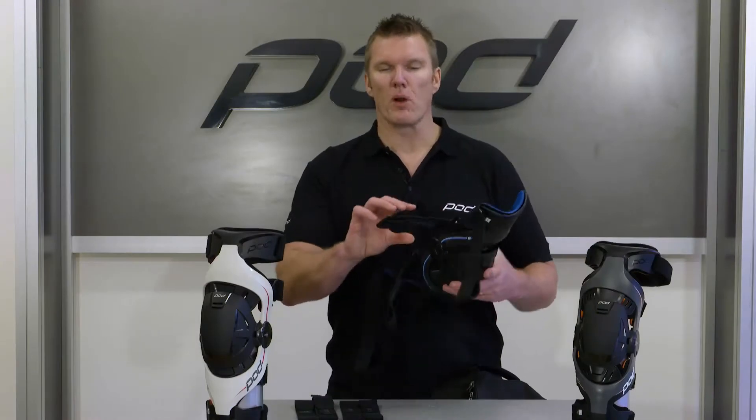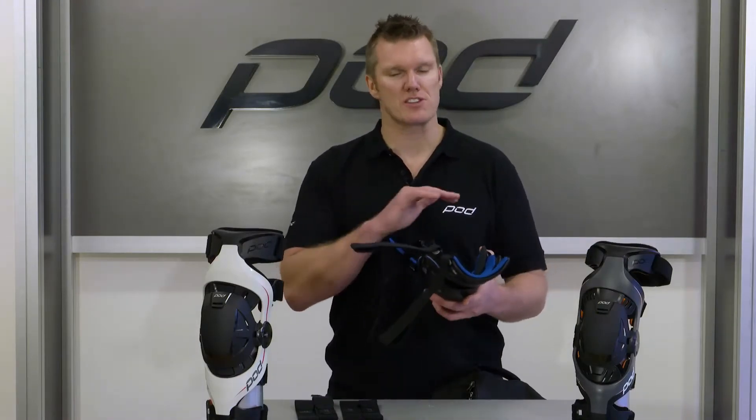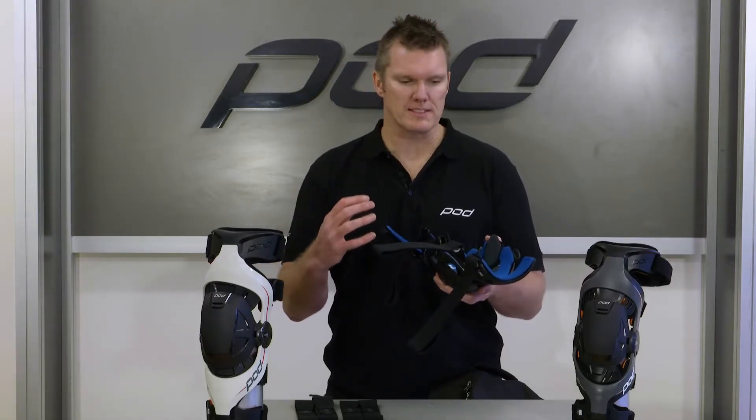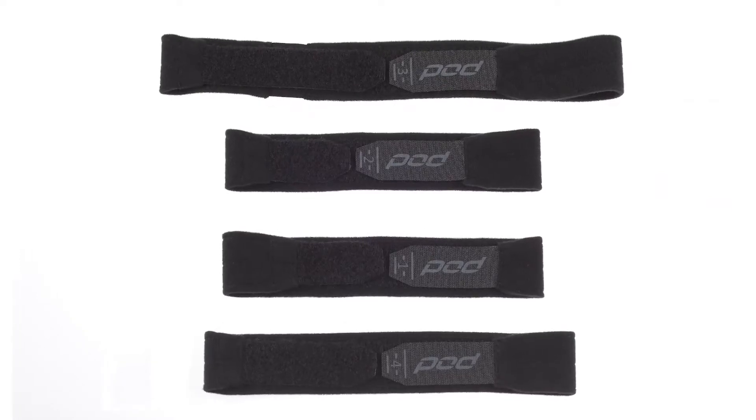But if you're to the point where the straps are truly thrashed, you've put in a lot of time on the bike, all the elasticity's gone and they're not holding the brace in place, it's migrating a little bit — then it's time to replace the straps.